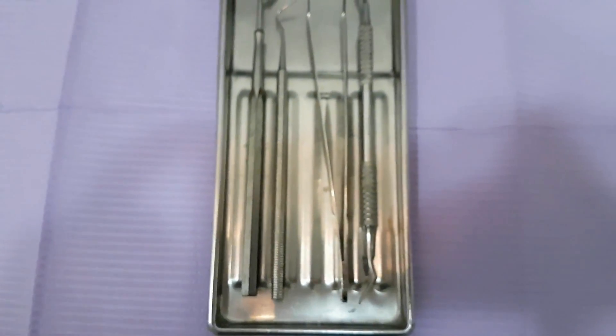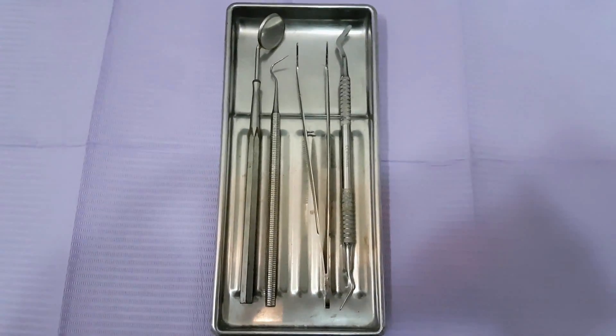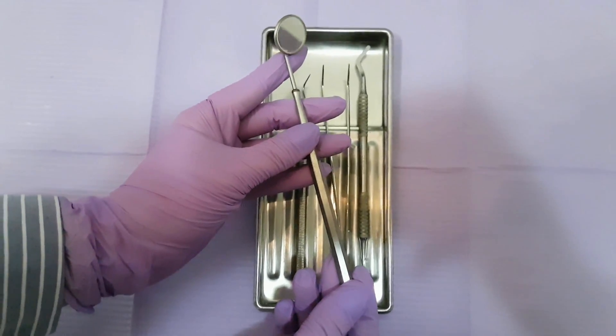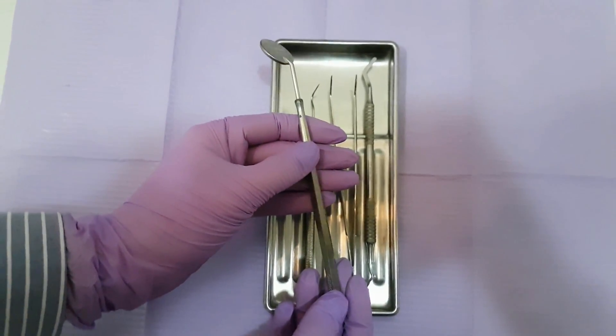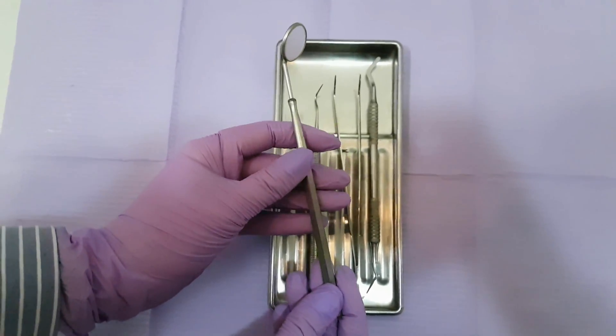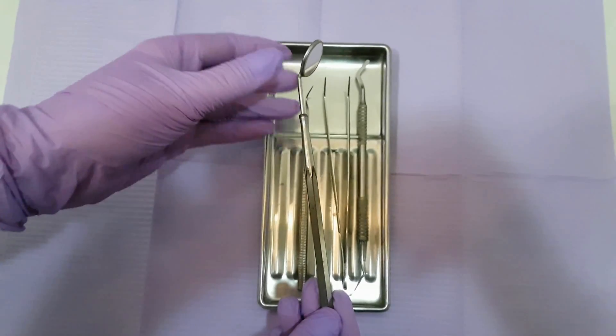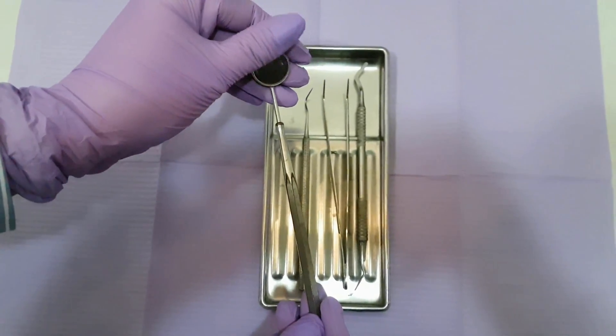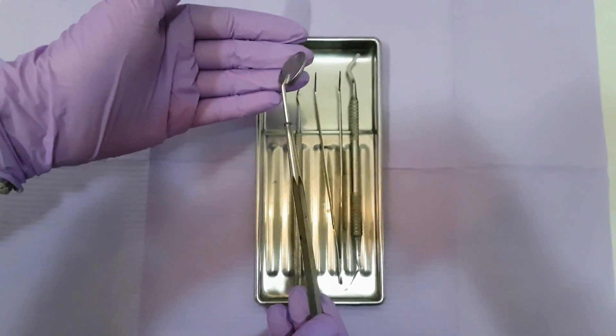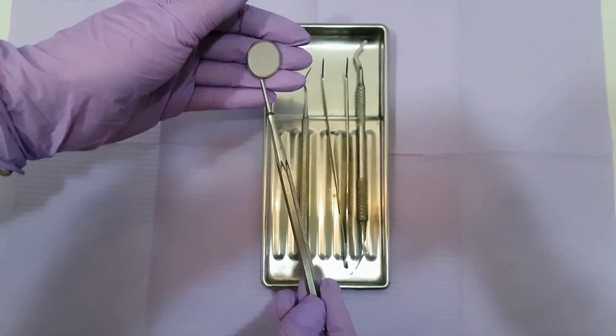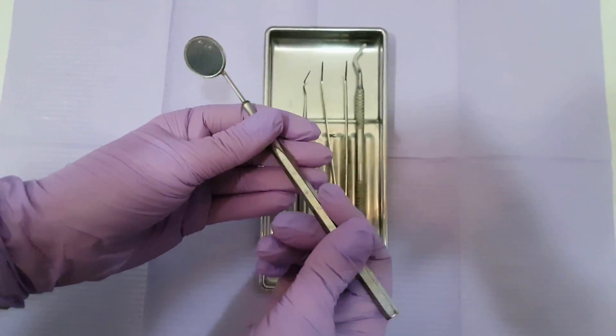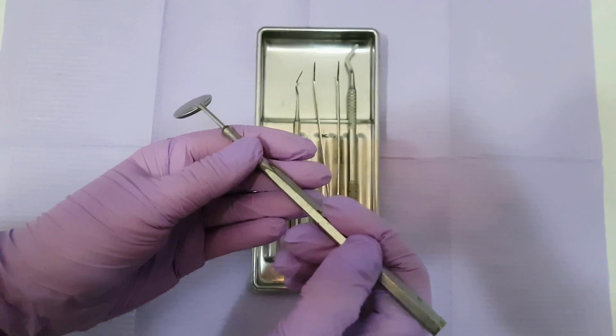First I would like to start with describing the dentist mirror. It has a handle and the working mirror part. This instrument has three basic uses: to retract soft tissues in a patient's mouth, to direct the light towards the tooth we want to work on, and to indirect view.